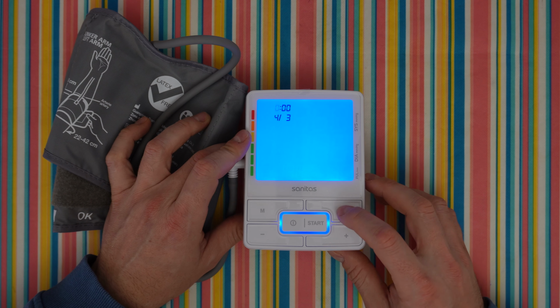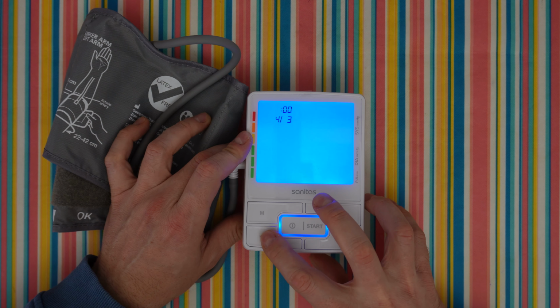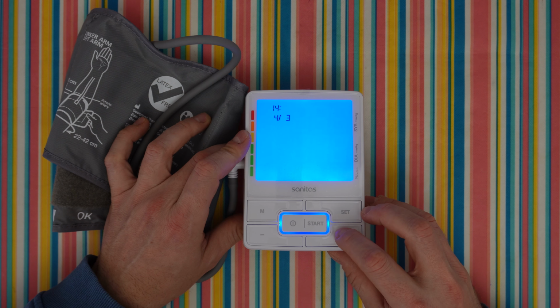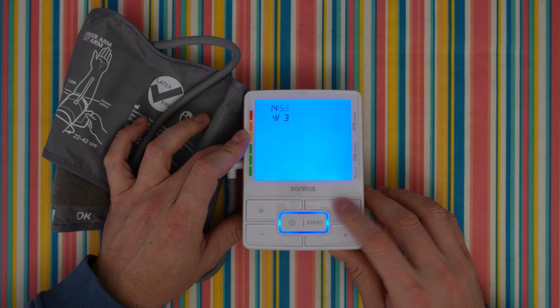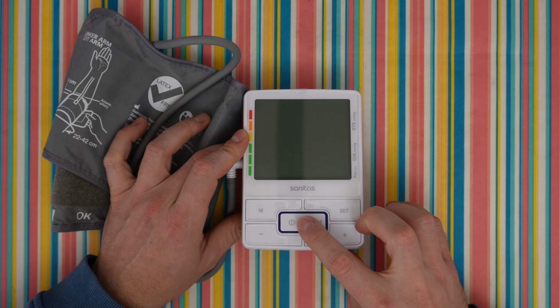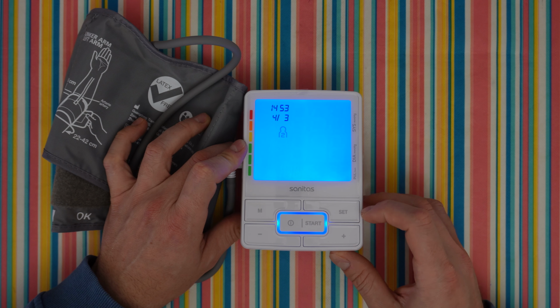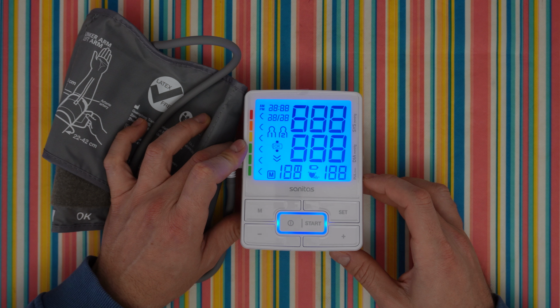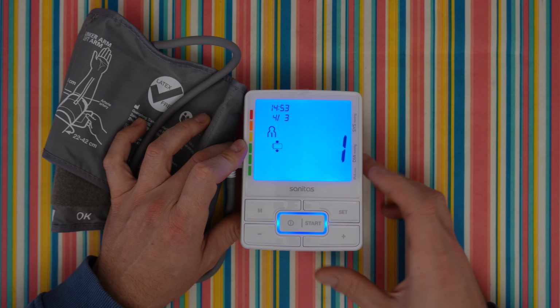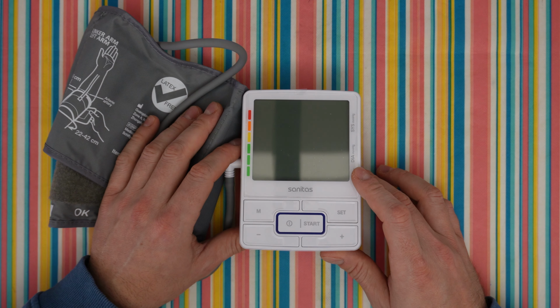Set hour, press and hold will go faster, set, and the minute, set, and on. You can choose the first user or the second user. First, start, and here we can see all the icons. And it will start automatically. Nope. I need to wear this cuff. Well, let's do that.